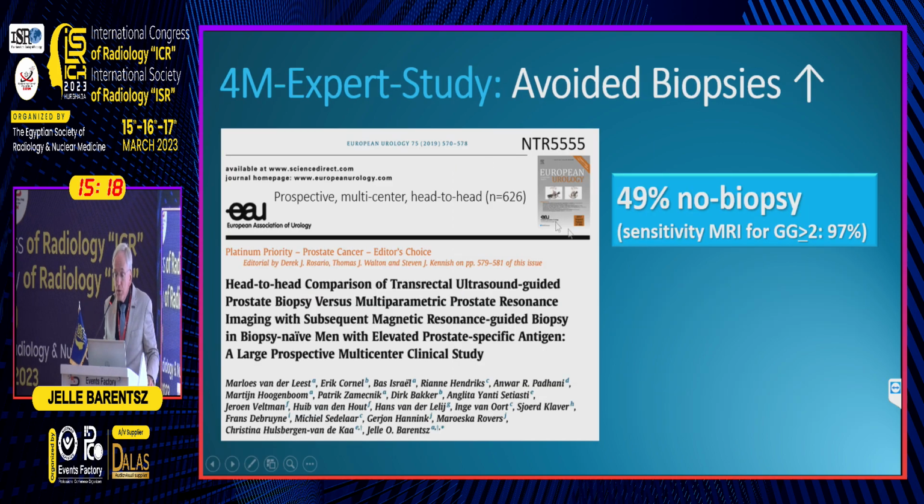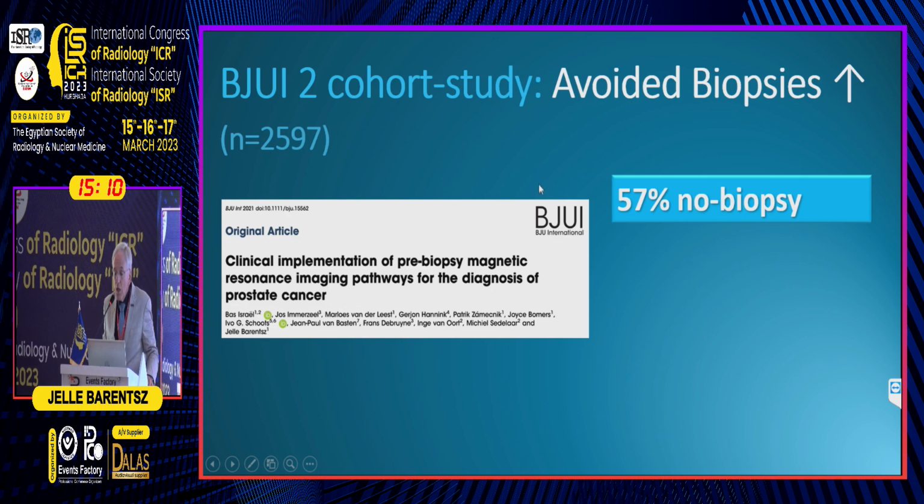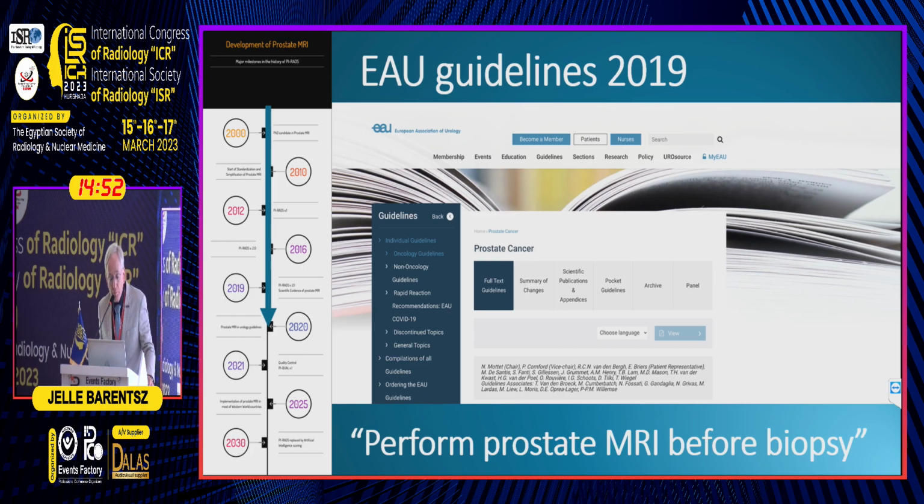If you have an experienced group, in half of the patients, you do not need the 12-needle biopsy anymore. If you have an implemented technique into the clinical world, into expert centers, you can go even up to 60%. So many men will benefit if you introduce MRI. And that is also why MRI is cost effective. In 2019, the European guidelines of the urologists changed, and 1 year later the AUA guidelines changed. And now it is in the guidelines that prostate MRI needs to be done before biopsy.